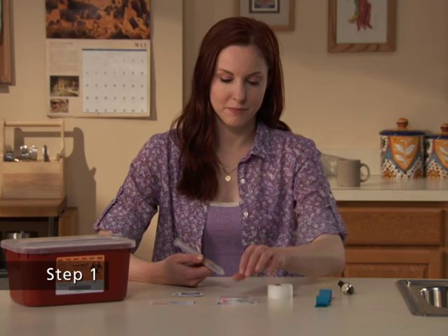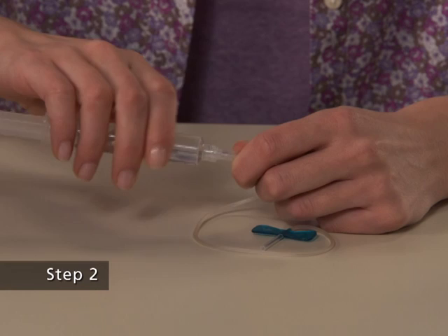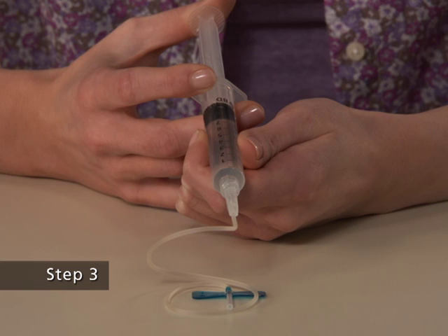Step 1 of the self-administration process. Leave the sheath on the butterfly needle. Remove the cap from the end of the infusion set, which attaches to the syringe containing the dissolved Synrise. Step 2. Attach the infusion set with a winged adapter to the syringe containing the dissolved Synrise. Step 3. Fill the tubing with dissolved Synrise by gently pushing the plunger of the syringe. Be careful not to spill the dissolved Synrise. This process replaces the air in the tubing with dissolved Synrise.